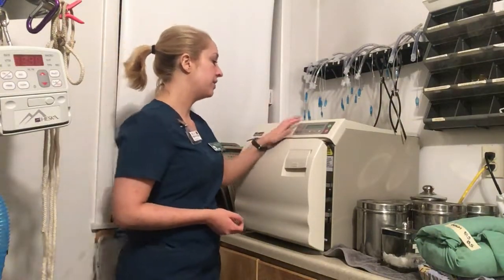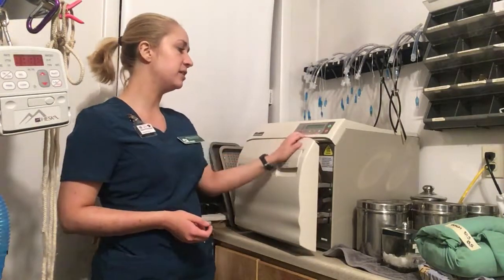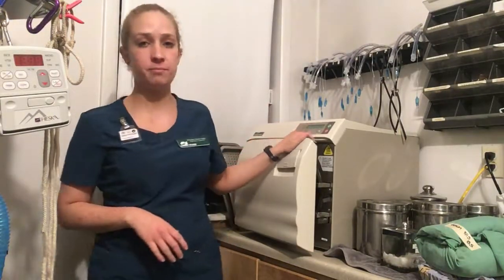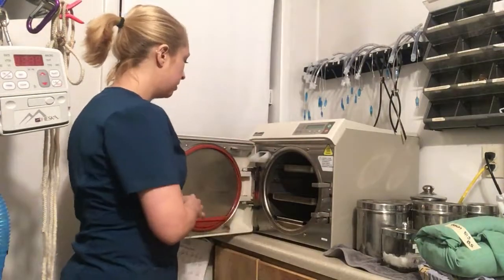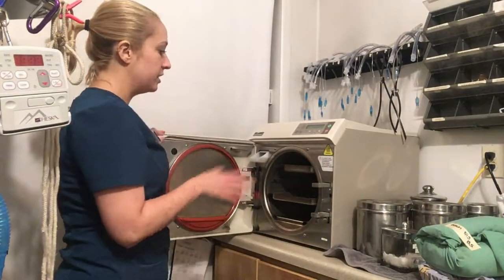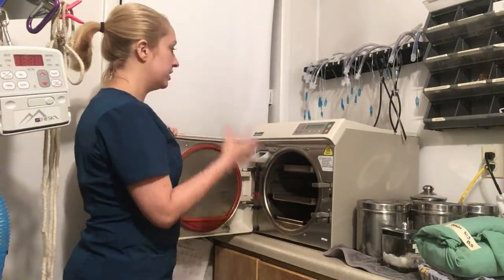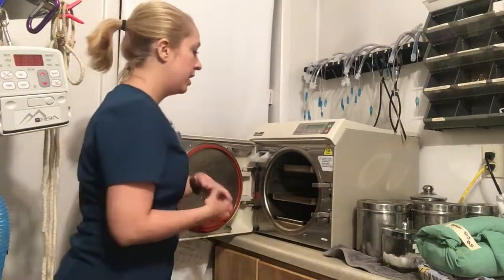So our autoclave has different settings. It has unwrapped, pouches, packs, and hand pieces, and that is where those ranges fall in, depending on what it is that you are sterilizing. So the way this one works, it is the sterile water, the distilled water that turns into steam and gets really hot and creates that pressure in the system.